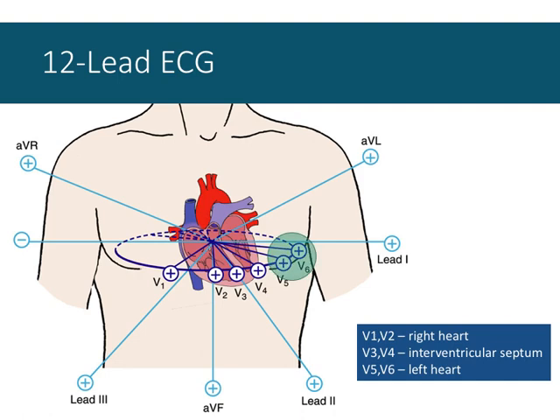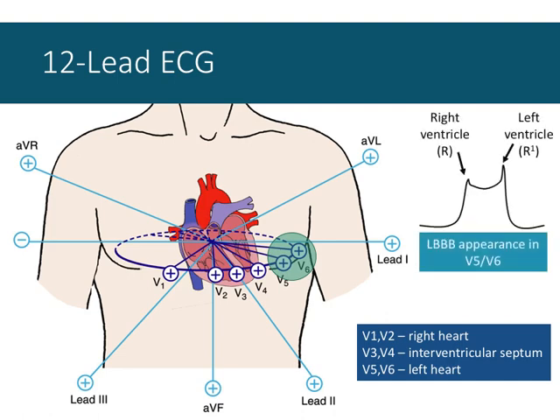But I wanted to reiterate as well that the notch or the bimodal QRS complex, if you're on the other side looking towards the right side of the heart, shows the right ventricle contracting and a notch before the left ventricle contracts. Similarly, if you're in V6, the last thing you see is the depolarization coming towards you, right?